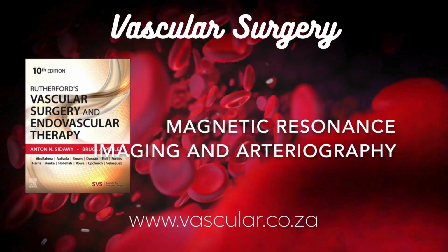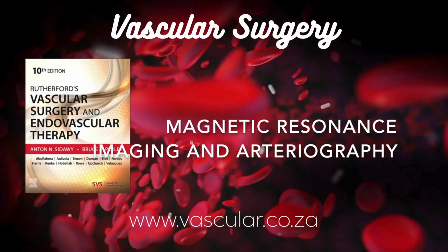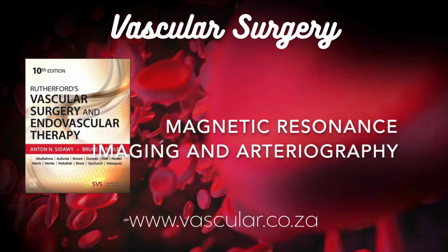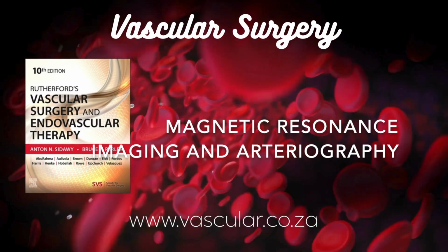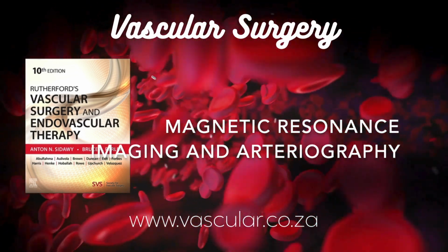Things like curved planar reformatting, which lets you straighten out a curvy vessel to see it along its length. Oh, cool. Automated vessel tracking to measure diameters, maybe tools for subtracting bone, though that's more common in CT. These advanced analysis tools can really aid interpretation, especially for complex cases.